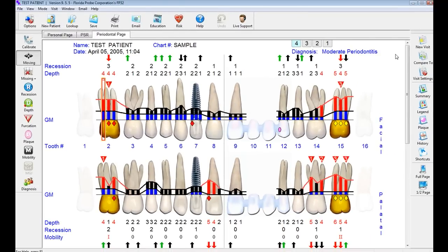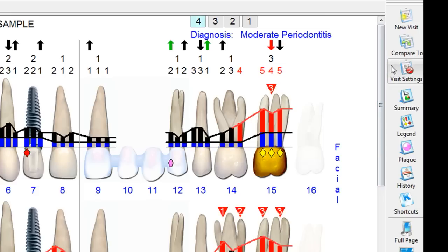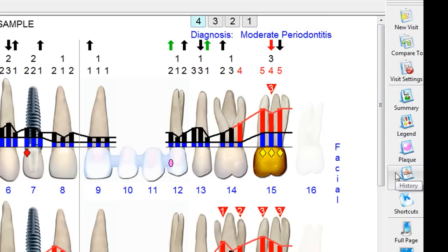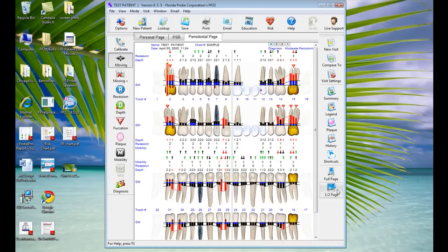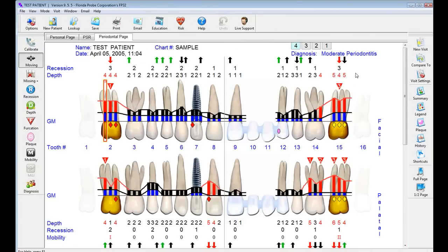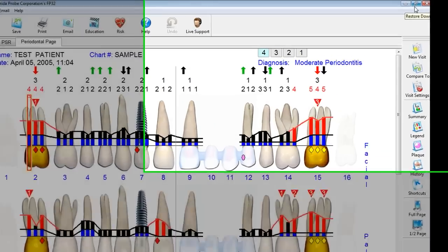On the right-hand side, once you've collected all of the data, this allows you to view how you want to see the data. We could create a new visit for this patient, compare it to a specific visit, control the visit settings or what we're going to chart in the future. We can look at the summary, legend, plaque data, history, per tooth, a shortcut screen, view the entire visit on one page, a half-page view, or expand it to the maximum size for the screen.